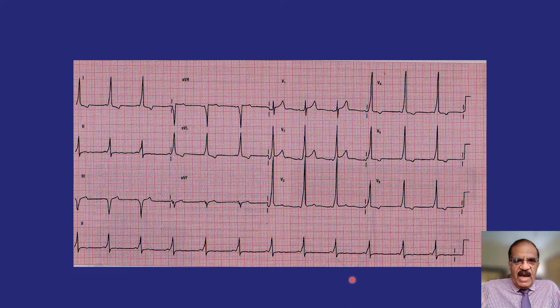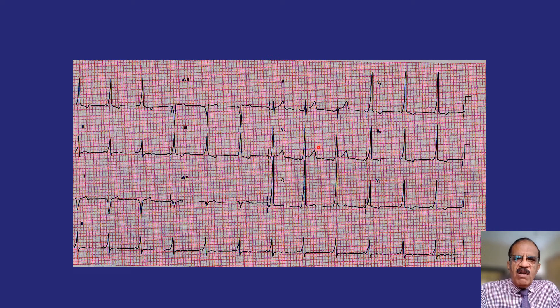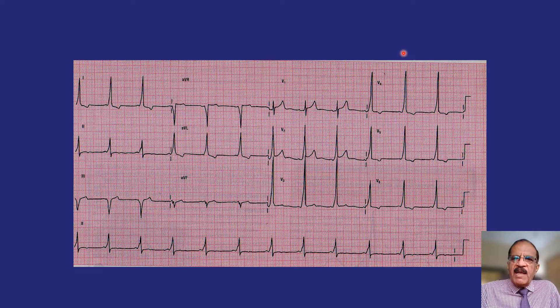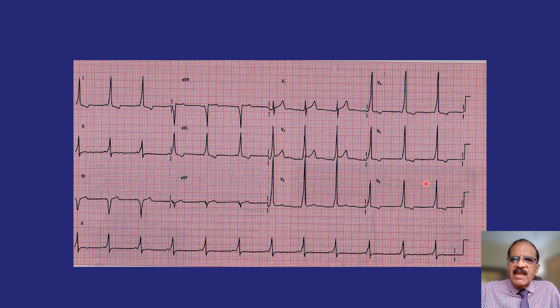Now let's do some ECG exercise. This ECG shows limb leads I, II, III, aVR, aVL, aVF and precordial leads V1 through V6. To study the rhythm, scan the entire strip from left to right. Several abnormalities are present: the QRS complexes are fairly tall and slightly broad, the PR interval looks rather small, and there are some ST depressions.